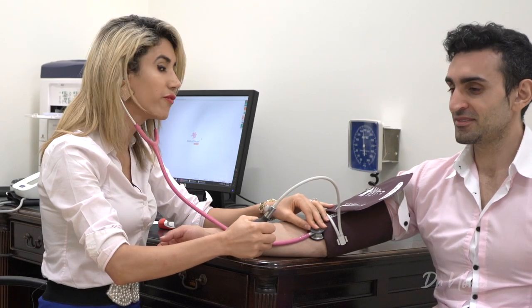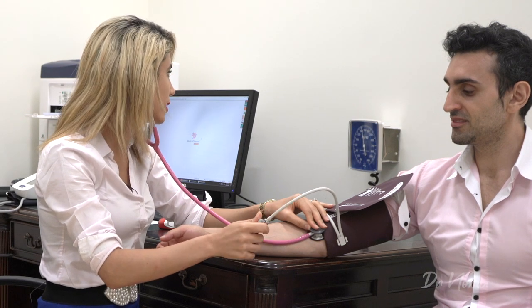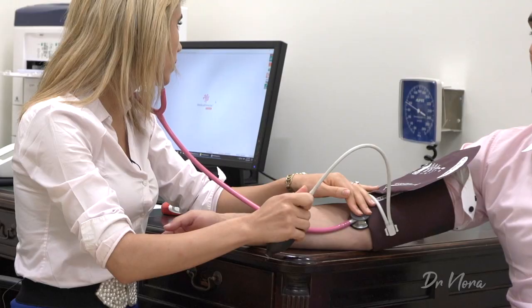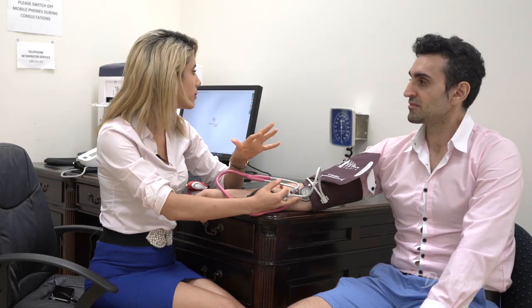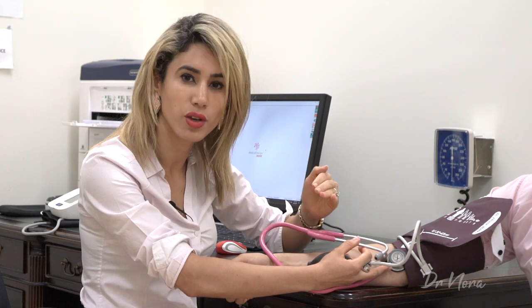Now I'm up to 150 and I'm going to very slowly release the gauge by two to three millimeters of mercury at a time, slowly, listening for those tapping noises — otherwise known as the Korotkoff sounds. The first time you hear those clicking or tapping noises corresponds to your systolic pressure. For this patient I made a mental note that this was at 90. You then continue listening, and eventually as you deflate the cuff, the sound becomes much fainter. As soon as those noises disappear, that is your diastolic reading. For this patient it was 50. So his blood pressure is 90 over 50.